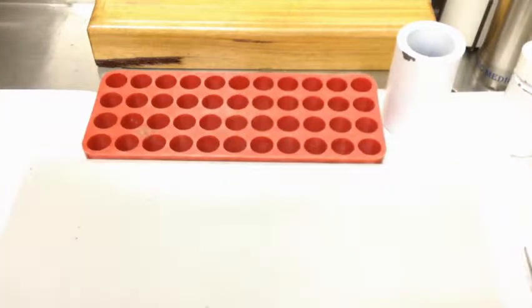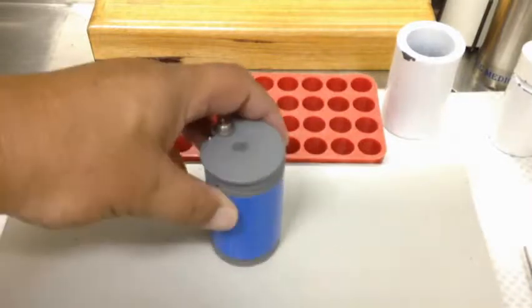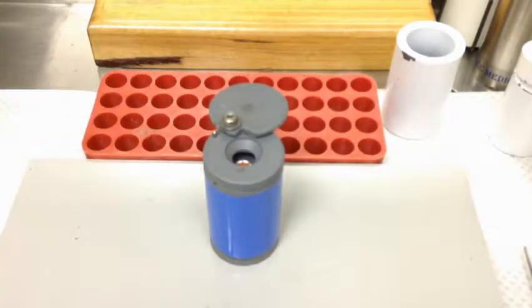The next demonstration is dose dispensing. We're going to use the MDP that we've just simulated making, so it's not radioactive. I'm not wearing gloves — this is just for the video.